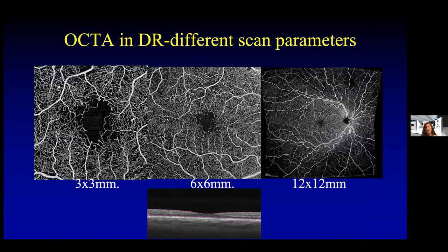Here's another diabetic eye looking at the different scan parameters. On the left, we see foveal details in the three by three millimeter scan. As we zoom out in the six by six millimeter scan, we can still see the foveal avascular zone, a small microaneurysm, regions of capillary dropout, and an irregular vascular loop. In the 12 by 12 millimeter scan, we have even more detail, and this is all accompanied with a structural OCT.